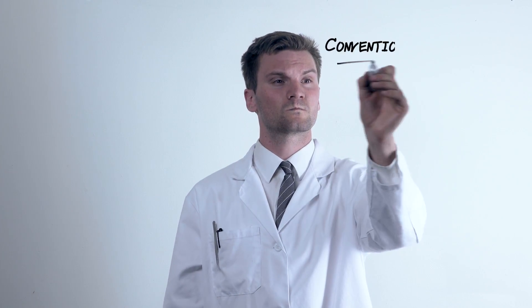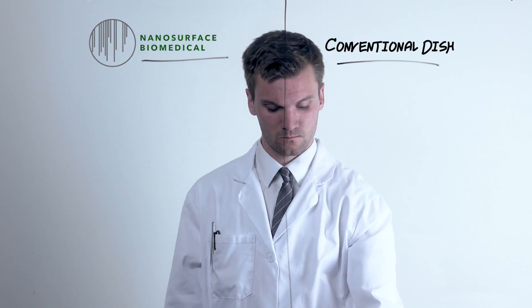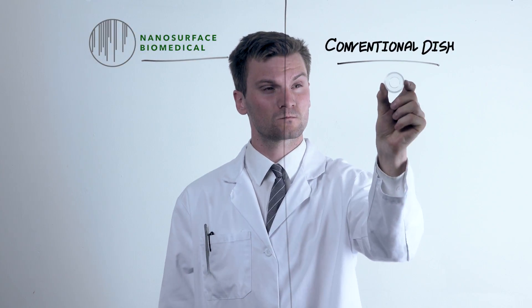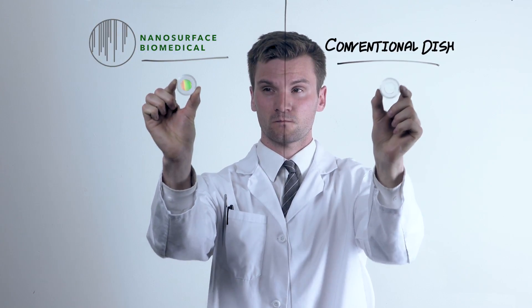Nanosurface Biomedical offers a powerful alternative to the conventional cell culture dish. Unlike conventional dishes, which do nothing to mimic the mechanical characteristics of the native cellular microenvironment, nanosurface dishes feature biomimetic, nanotextured surface topography.